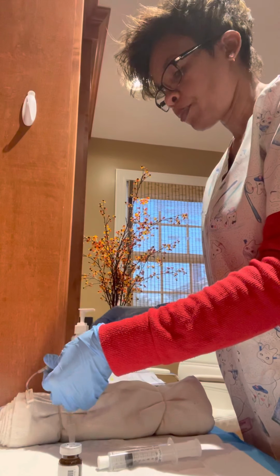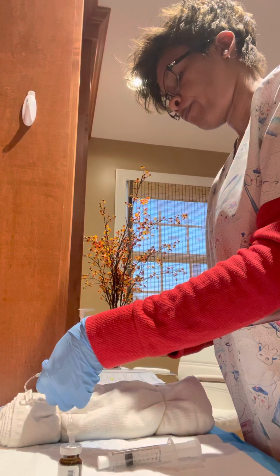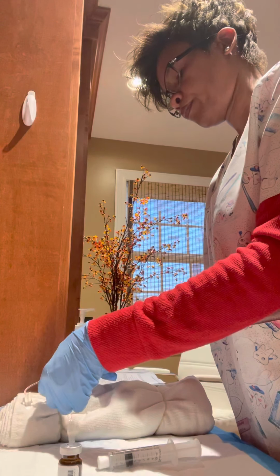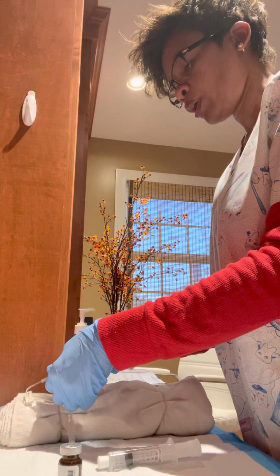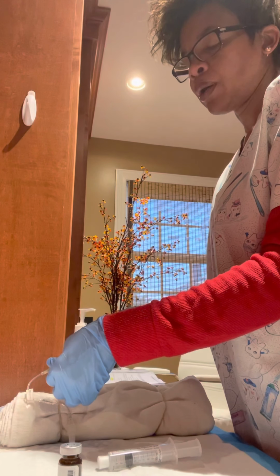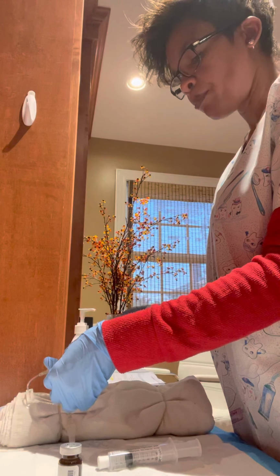So now I'm just going to, and I'm going to do this over 60 minutes, 60 seconds rather, a minute.